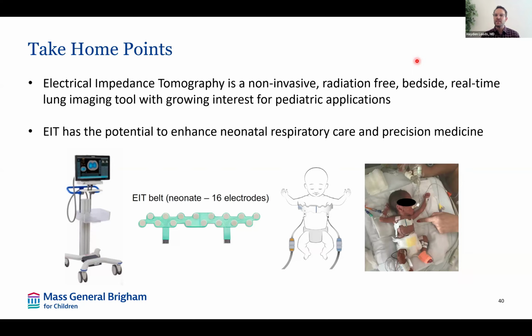The next question is about pendelluft and whether you have had any cases of this and whether you can identify that with the EIT. This is, again, another exciting point with being able to see real-time physiology at play at the bedside. Yeah. So we looked for pendelluft in our BPD population, but we didn't see it. We only had 5 assessments. It could be that BPD is such a wastebasket kind of diagnosis, meaning it's not very specific to the lung pathology.